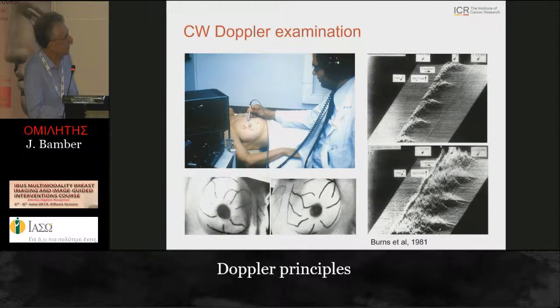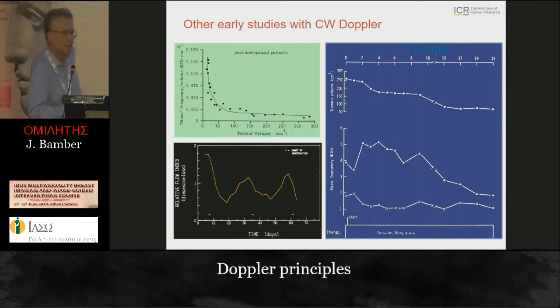So on the contralateral breast, you could often use that as a control to compare the vascular pattern with the suspected breast. And that was thought to be a useful technique. In a busy clinic these days, a lot of these ideas have tended to be lost. So I'm sort of describing some of the history of the subject to you so that maybe you can think about it for what you want to do.